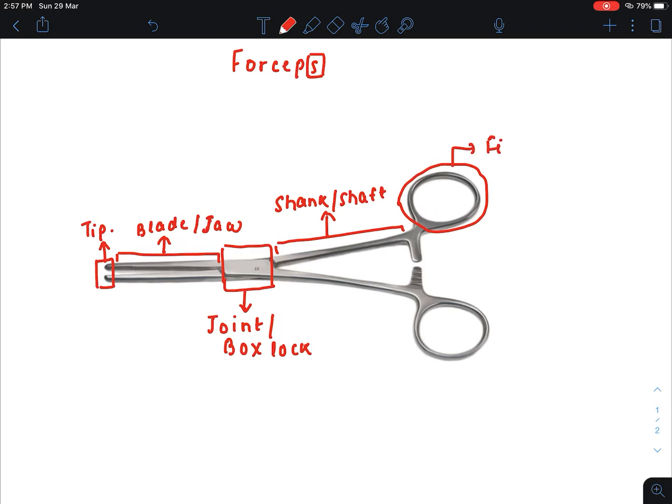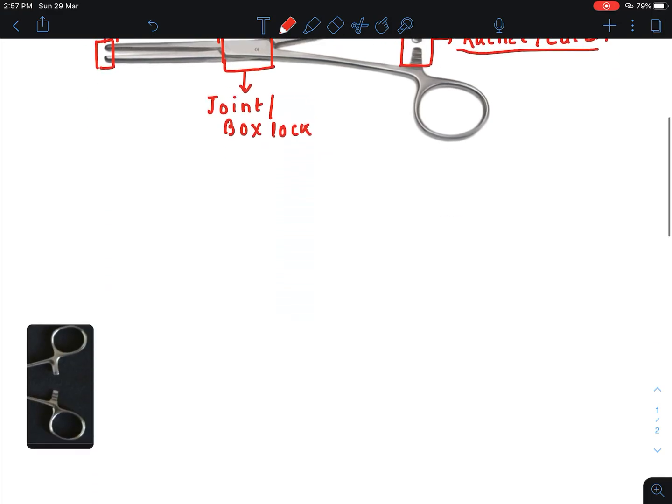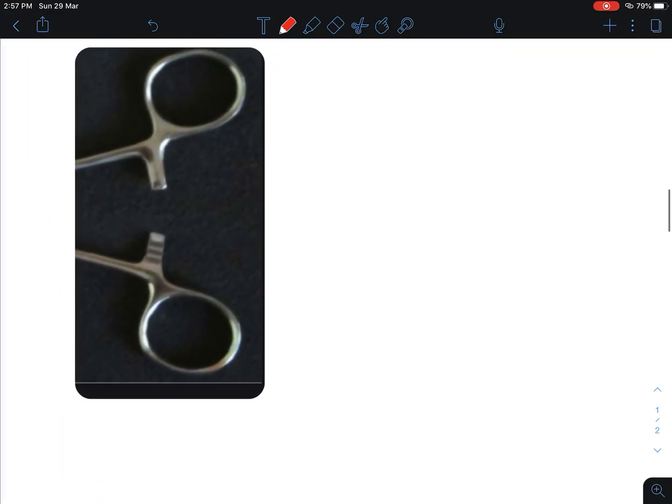This part is known as finger bows. It is also a paired structure. It is used to grasp the forceps and it controls the jaw movement by the fingers. This part is known as the ratchet, also known as the catch. It is used for interlocking the parts of the instrument.